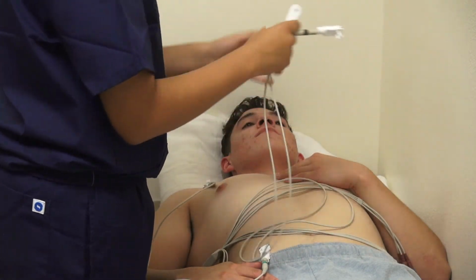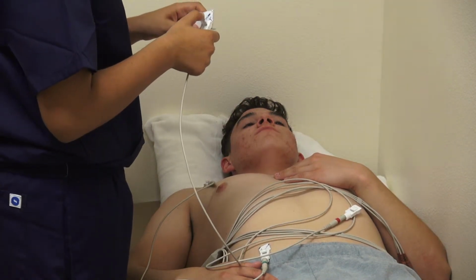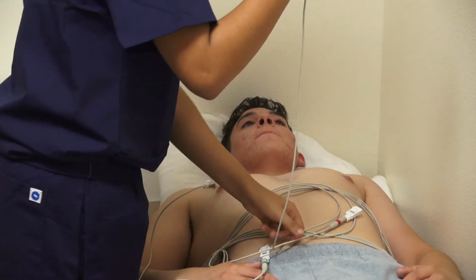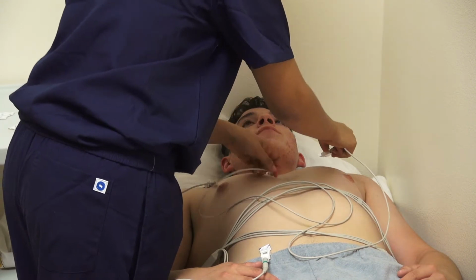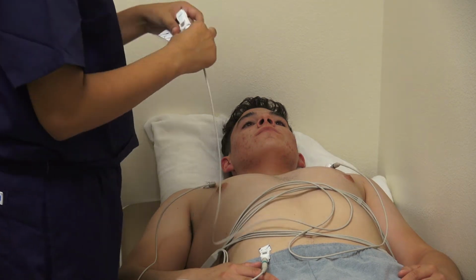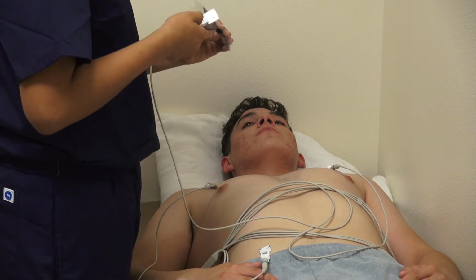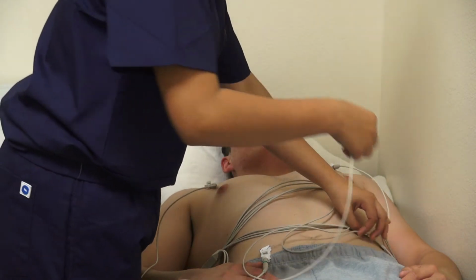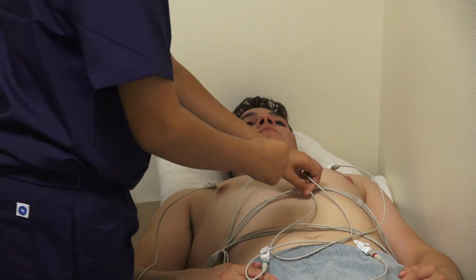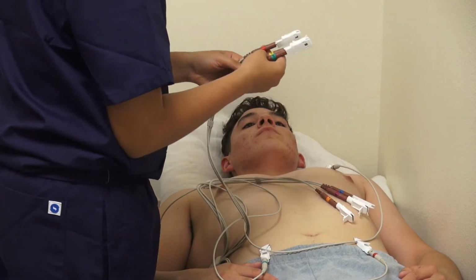After placing the green lead, you can now place the black lead, and that will be placed in the left shoulder area. And then the last limb lead is the red lead, and that will be placed in the left lower abdominal area. Now once all of the limb leads are in place, you will then move on to V1 through 6.